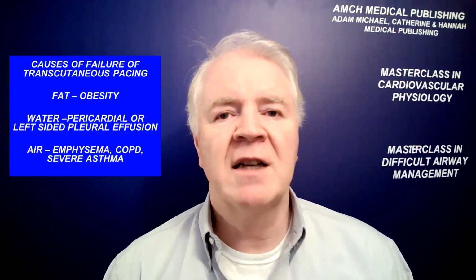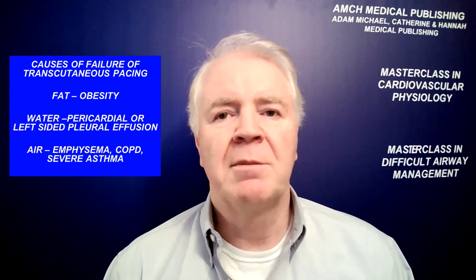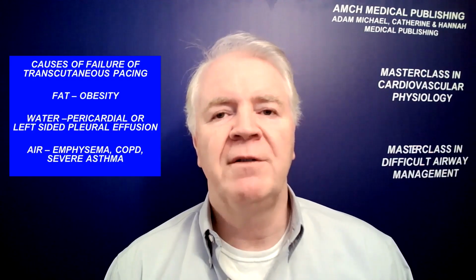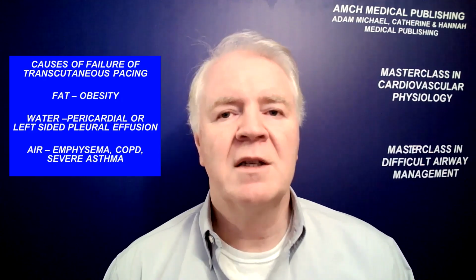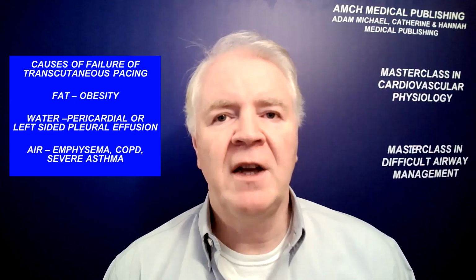Transcutaneous pacing can also fail if there are electrical insulators between the chest pads and the heart, such as fat, water or air, specifically the very obese, in the presence of a left-sided pleural effusion or pericardial effusions or even severe emphysema. In these conditions, where the heart is insulated, we may see total failure of transcutaneous pacing, and so consider emergency transvenous pacing and request an expert cardiological consult STAT.